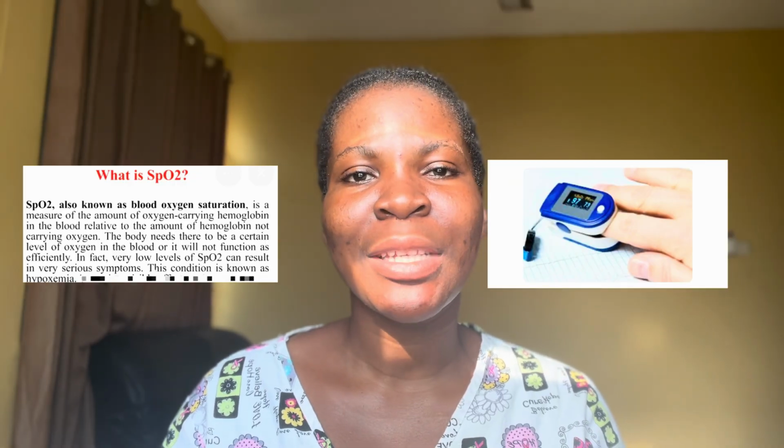So we are done with all the components, but in the hospital we add SpO2 when we are checking vital signs. Okay, so for SpO2 we use the pulse oximeter. And with that one the normal range is from 95 to 100. 95 to 100. I hope this is helpful to you watching this video.